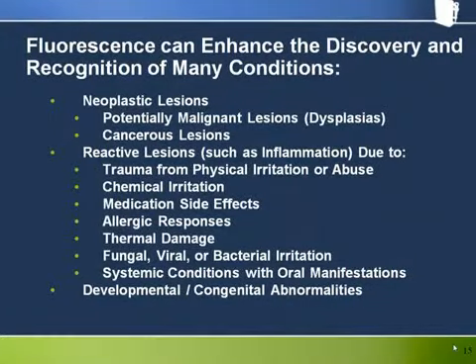Well, we focused on the reasons why we expect to see a loss of fluorescence from dysplasia and cancer. However, it is important to understand that fluorescence pattern changes are associated with many different types of lesions. Moreover, this is a benefit rather than a limitation of fluorescence visualization. To be sure, neoplastic lesions are arguably the most serious and life-threatening in the spectrum of diseases that affect the oral cavity. However, the many other types of conditions are definitely worthy of the clinician's attention and can have a significant effect on the quality of life of the patient.